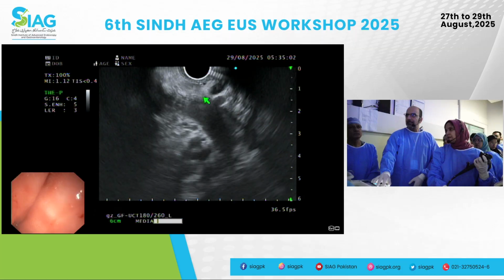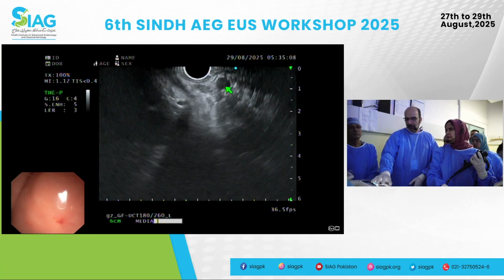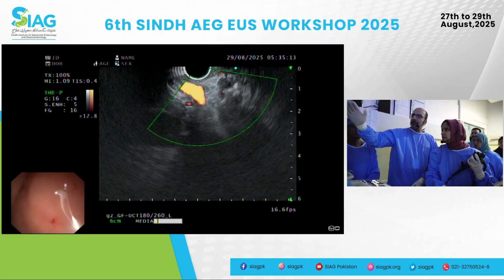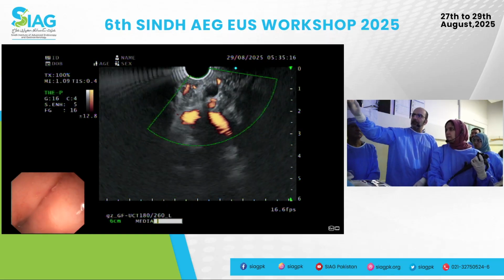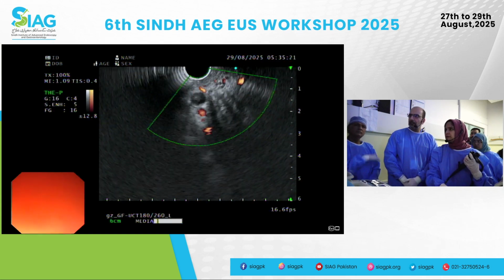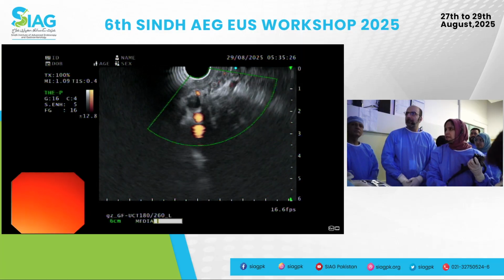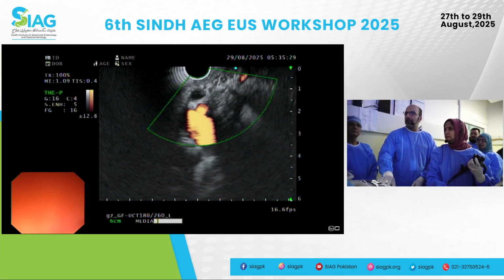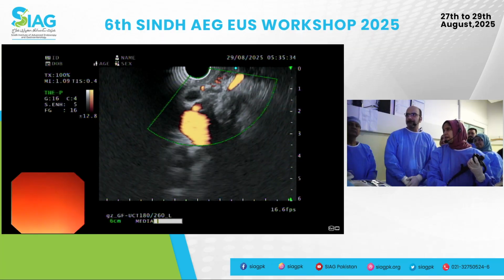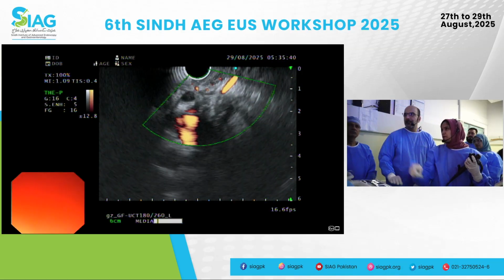What about this structure here? This seems like again a vascular structure. I think we put a Doppler on it last time, and no flow came out. So what's between the portal vein and the probe? Try and get this into the middle. I'll pull back the scope a bit. Move the big wheel to my side. Good. Now push forward a tiny bit, and big wheel towards you a tiny bit. There you go, that's better. So what do you think? What's usually from the bulb between the probe and the portal vein with no flow? PD. Basically, CBD is expected to come from above.